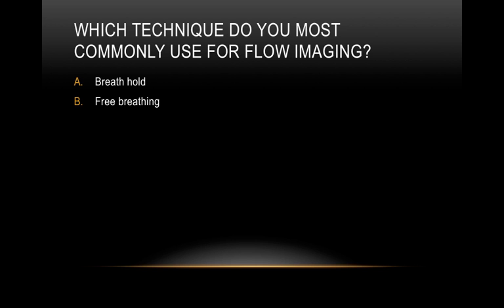Which technique do you most commonly use for flow imaging? A, breath holding, or B, free breathing?